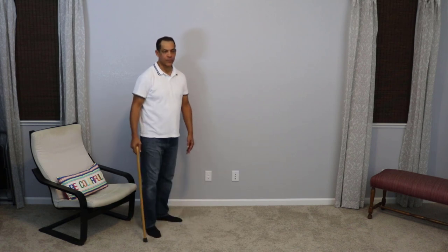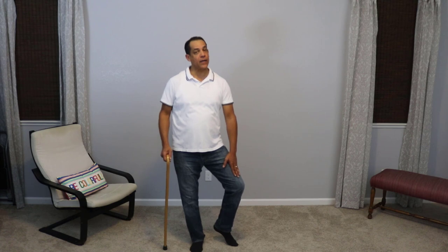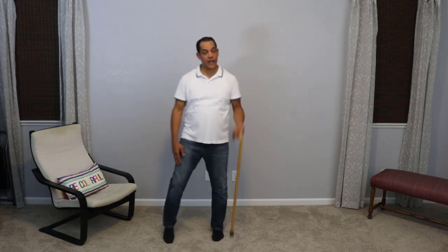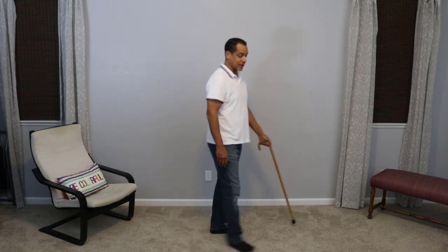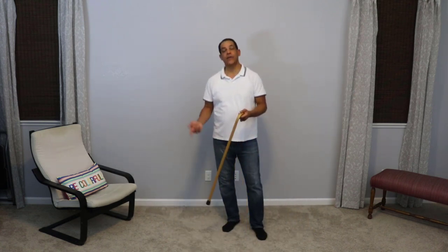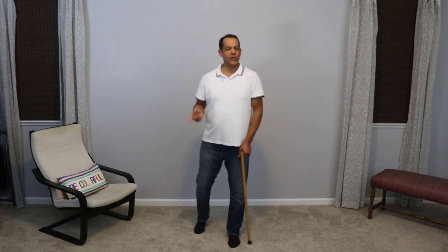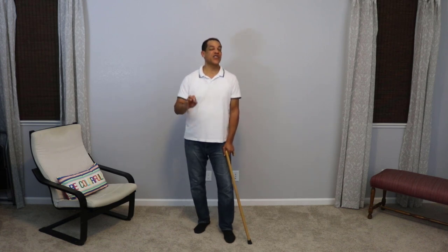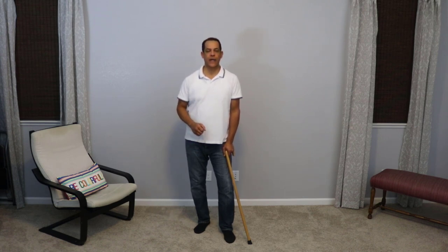So again, using the cane in the opposite hand of your bad knee. If my right knee was bad, I would use the cane in my left hand. Some people may have a problem using the cane in their non-dominant hand, but if you have a bad knee, the best thing to do is use the cane on the opposite side and maybe just slow down a little bit. Practice — it will become more natural for you.